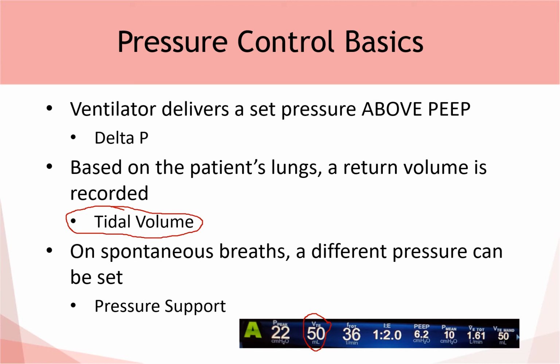In addition, it's also important to note that a patient that's breathing spontaneously, that has no paralysis on board or is breathing above the ventilator, will get the benefit of pressure supported breaths, which are also selected. And those pressure supported breaths are, again, pressure support that gets dialed in.